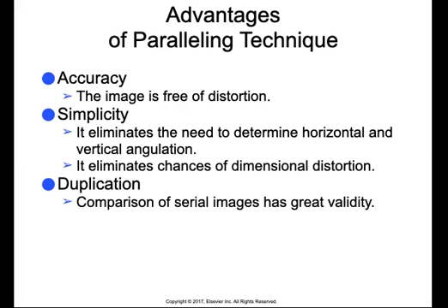So the primary advantage is that the paralleling technique produces an image without dimensional distortion.